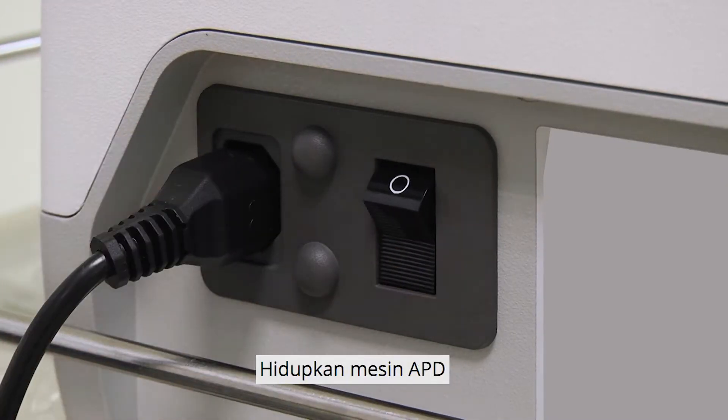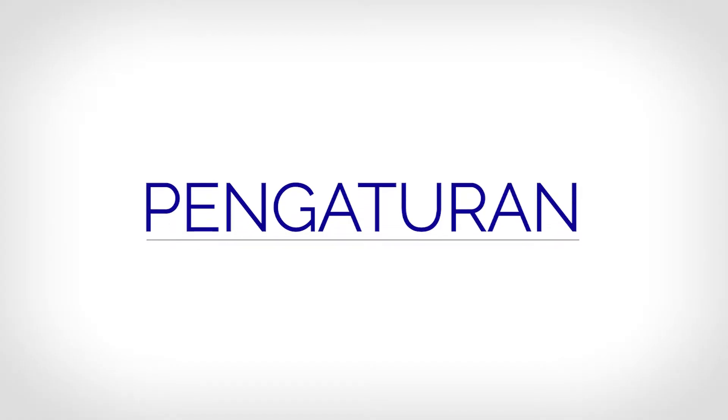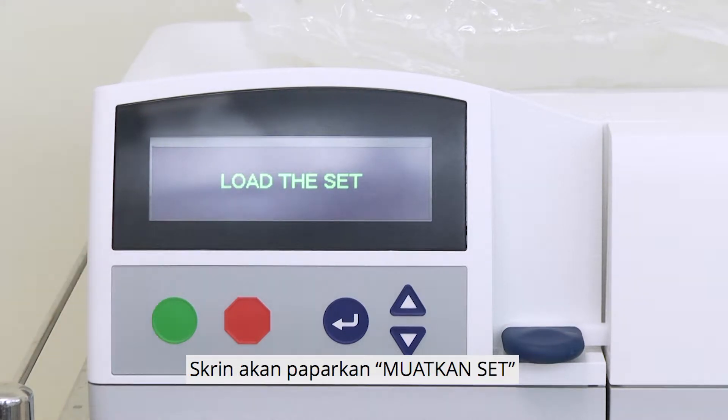Setup. Switch on the APD machine. When the machine is ready, the screen will show 'Press go to start.' Press the green button to begin the setup. The screen will show 'Load the set.'